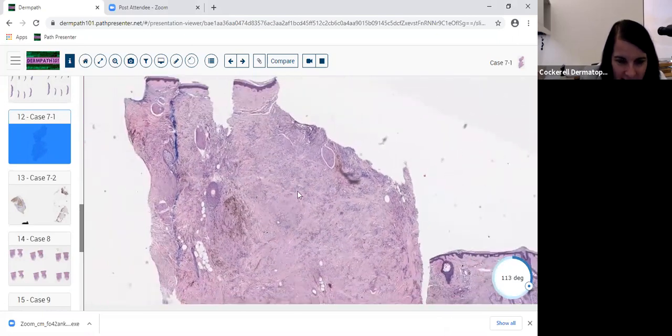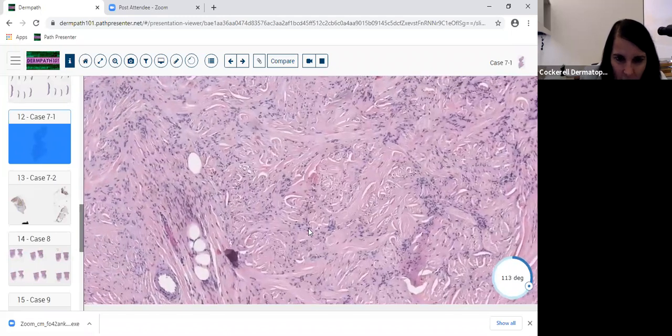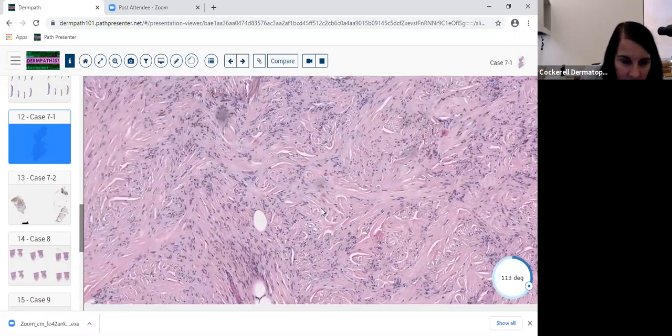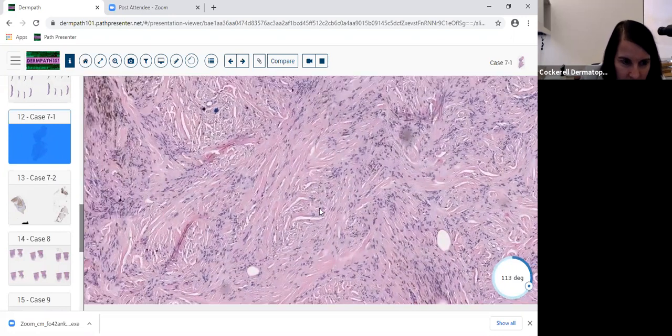And I'm going to tell you that right now, because then they can justify failing someone because they're overcalling things malignant that aren't malignant. This tumor here is perfectly benign. It's a blue nevus. It's somewhat sclerotic in areas, and in other areas, it's cellular. So it's exhibiting a couple of the features of the subtypes of blue nevi.